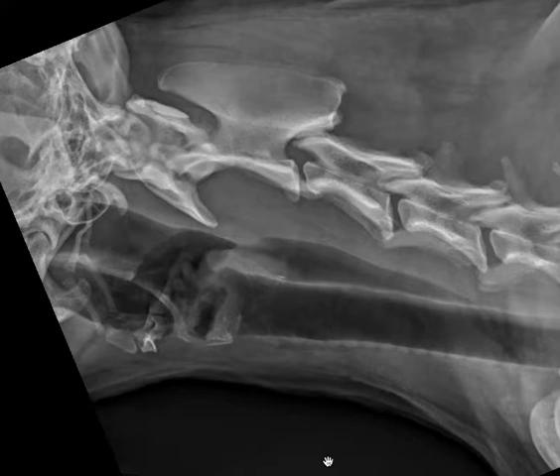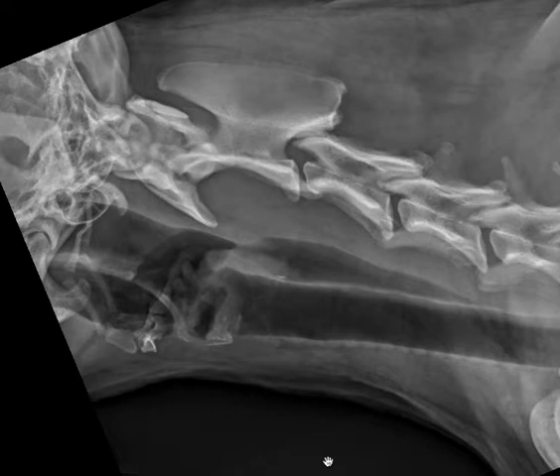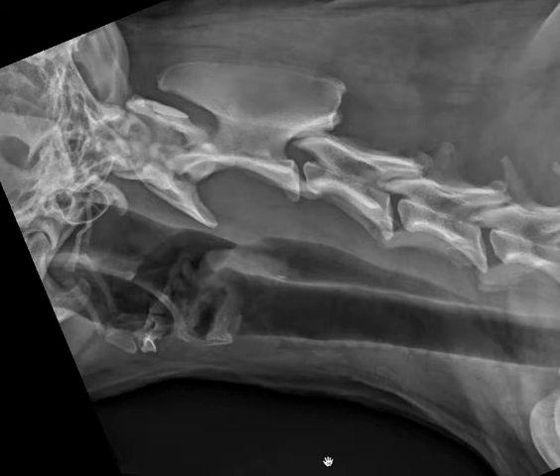Some reasons that I think this area is tricky: first of all, making good radiographs of this region can be difficult. It can be a really difficult area to keep straight because of the patient's head position. Additionally, if you're making a radiograph of the larynx region, it could be that the patient is having difficulty breathing or in distress, and that can mean you won't have the luxury of giving sedation to improve the radiographs. There's also a lot of complicated anatomy superimposed in a really small area, so all of these things come together to make it sometimes a really tricky little area to assess.